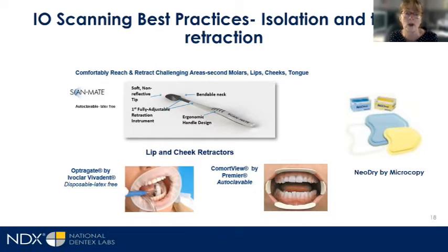It works wonders. It's amazing that we don't really think about it, but when we're using the scanner and we retract the cheek, we're pulling the cheek, we sort of milk that parotid gland, and then all of a sudden there's a bunch of saliva on the mandibular arch, and you're wondering, where is this all coming from? So that sort of puts that at bay.